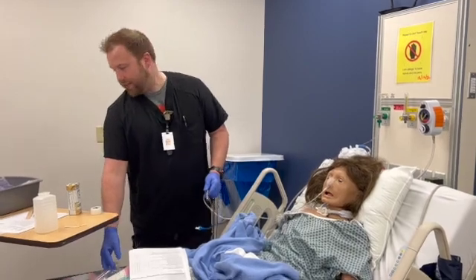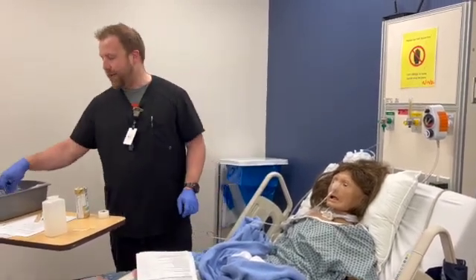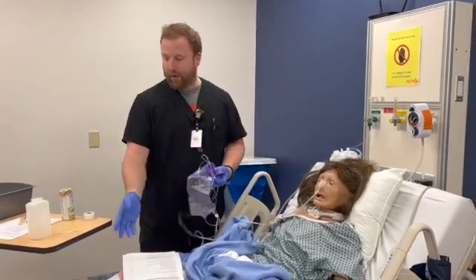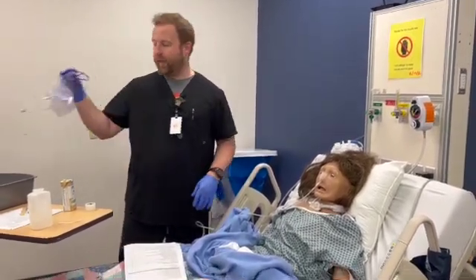You want to explain how to do it with a pump. You'll have a bag here. You would pour your tube feeding in, and you would just follow the orders and place the correct amount on the pump.